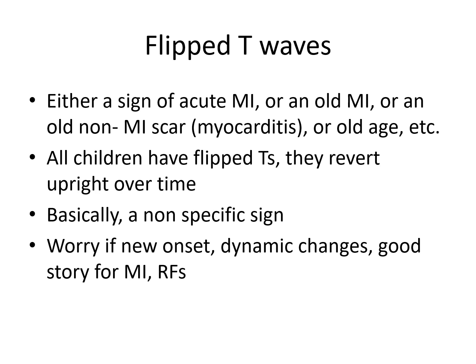Similarly, young children all have flipped T's and they all revert upright over time. So basically it's a non-specific sign. So you really have to look at the clinical context to see if it means something or not, and always compare it to the previous EKGs.